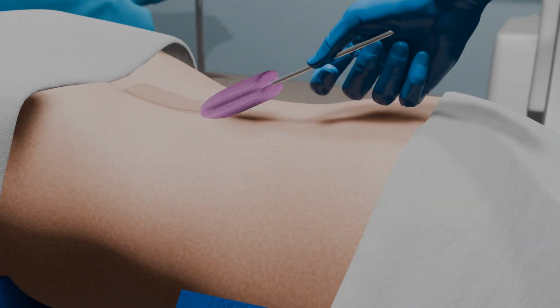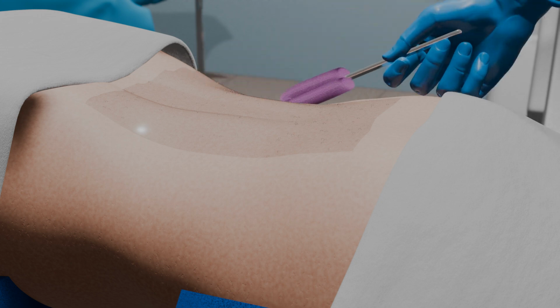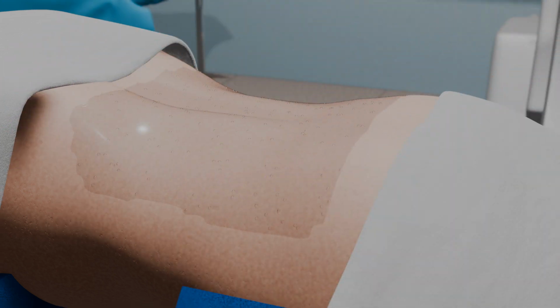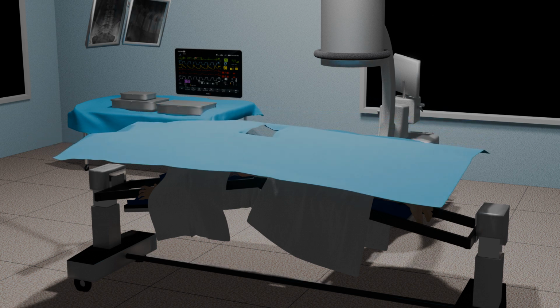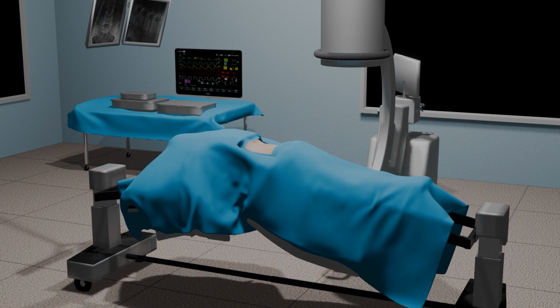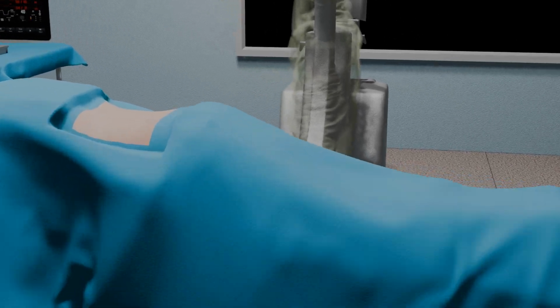The surgical area will be prepared for surgery with an antiseptic solution. You will also be given antibiotics by vein. A sterile surgical drape will be used to isolate the sterile field. A sterile plastic drape will also be placed over the C-arm. A strict surgical environment over the surgical area will be maintained to minimize the risk of infection.